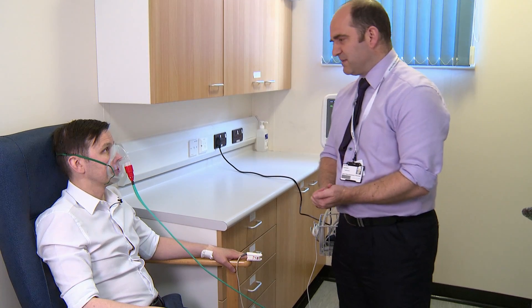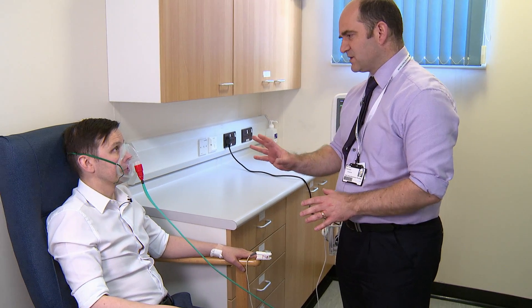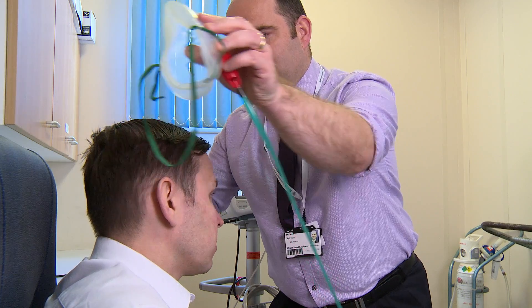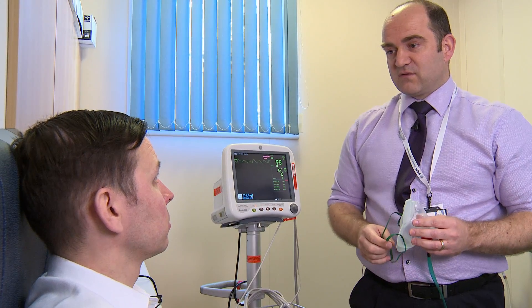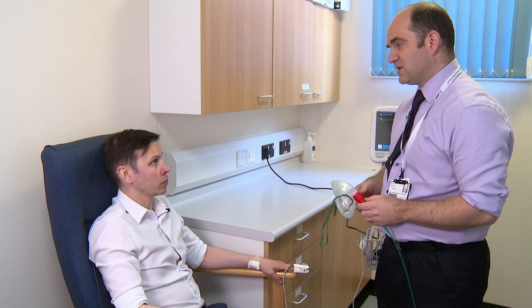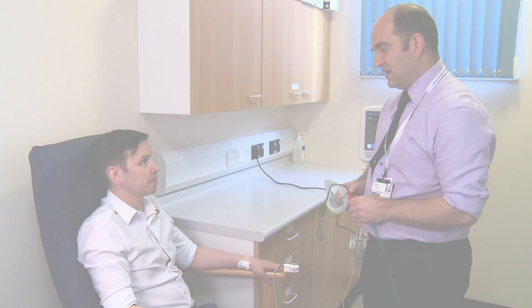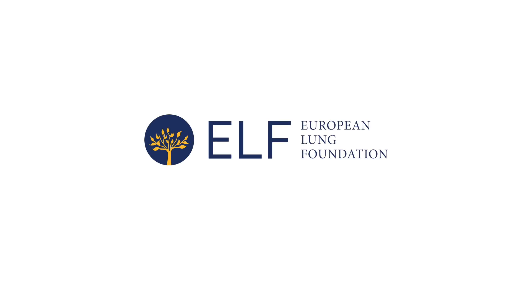Okay Matt, that's 20 minutes up. Well done. We can take the mask off for you now. I'll go away and analyze that result, and then I'll let the doctor know what the outcome of the test is. They'll be in touch about whether you need to have any oxygen on the flight or not. Is that all okay? Yes. Thank you.